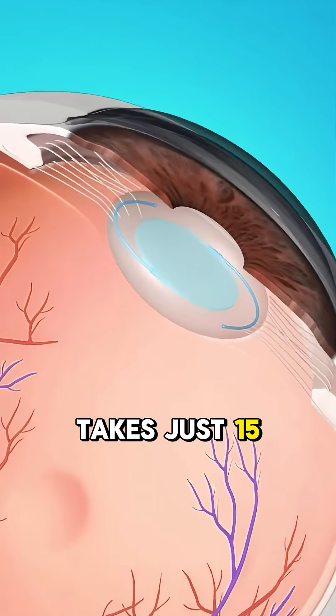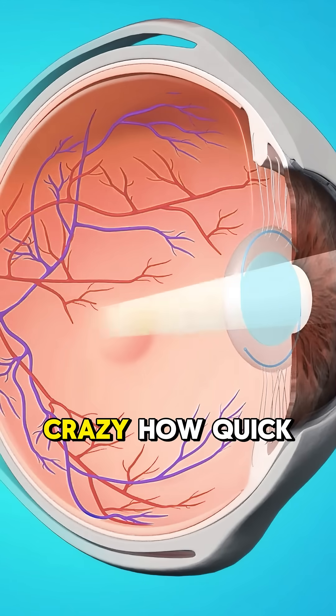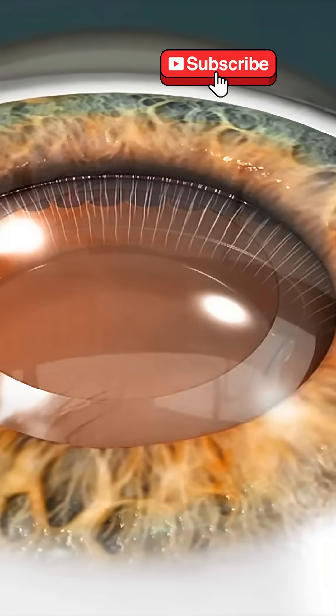And the best part? The whole thing takes just 15 to 20 minutes, and usually no stitches are needed. Crazy how quick and life-changing it is, right? Share this with someone who might need it.